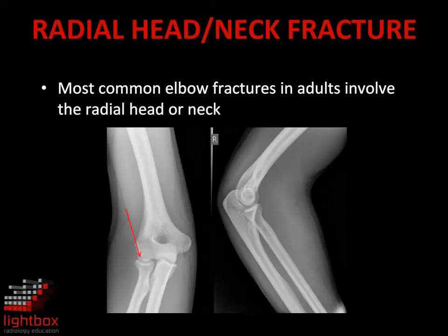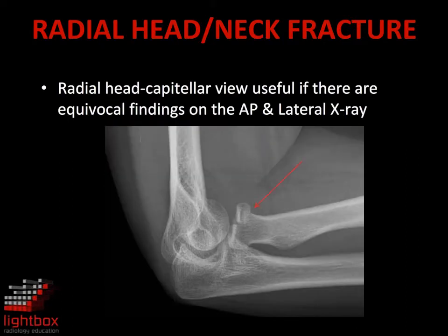In adults, the most common injury of the elbow is a fracture of the radial head. These appear as cortical disruption, linear lucency, or impaction sclerosis. It is important to assess for intra-articular extension. If minimally displaced, these fractures can be difficult to visualise, and the radial head-capitellum view is often useful. Usually these fractures are within the joint capsule and associated with a haemarthrosis.